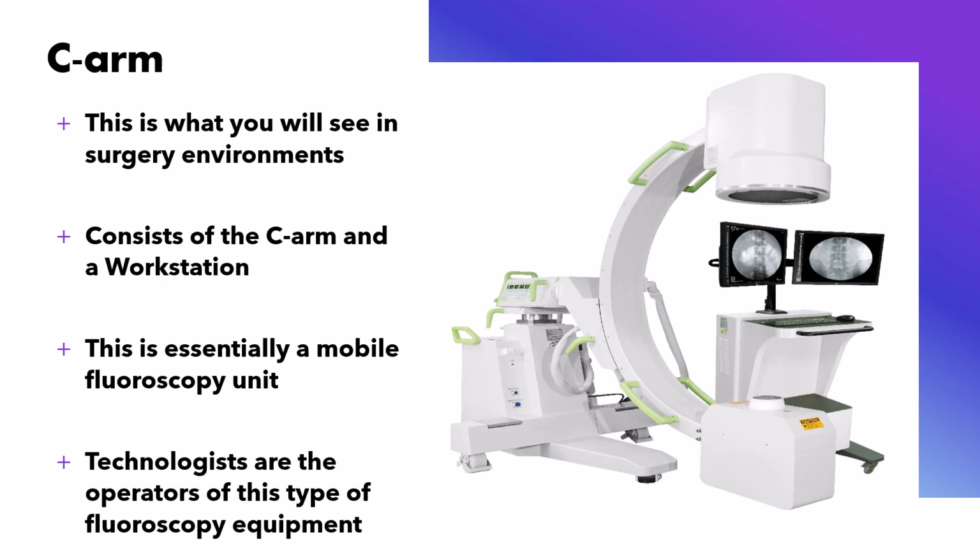That's why we get real specific, especially on the extremities, where you center actually over the joint, because if you're not really centered over the joint, then you're going to get image distortion.